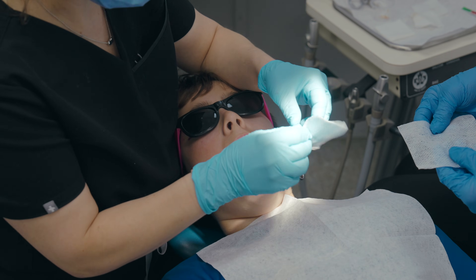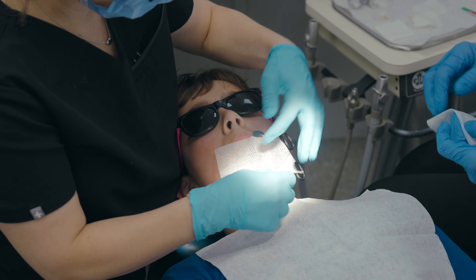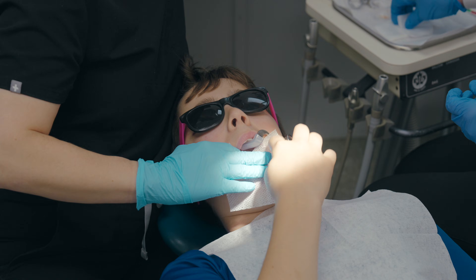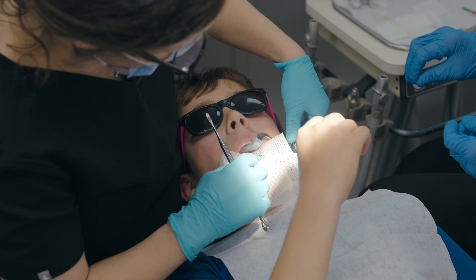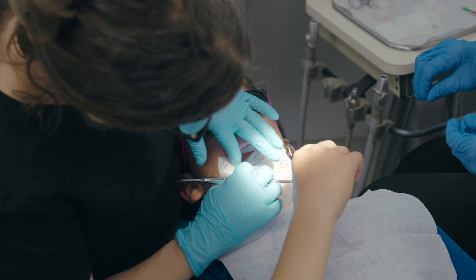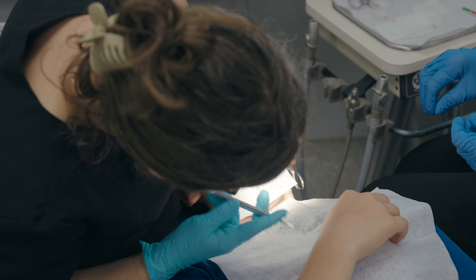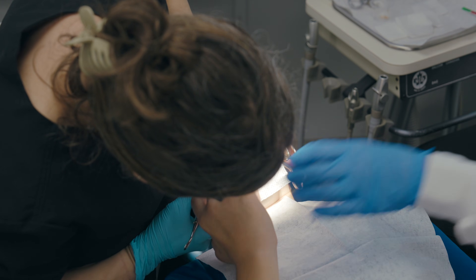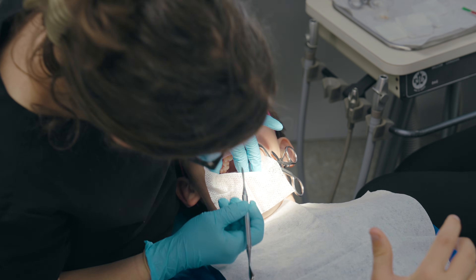A periosteal elevator is used to release the periodontal ligament around the tooth to be extracted. Notice the patient becomes upset and wants to communicate. It's always a good idea to give the patient a sense of control by asking them to raise a leg or hand if they need a break, have something to say, or need to ask a question.